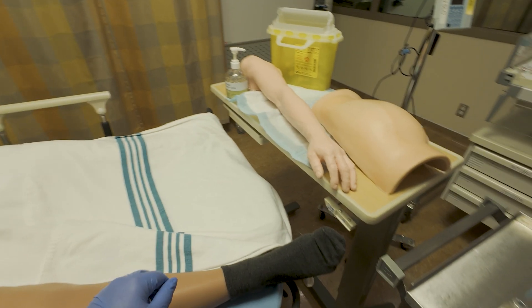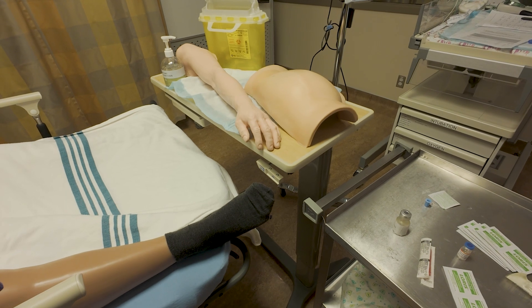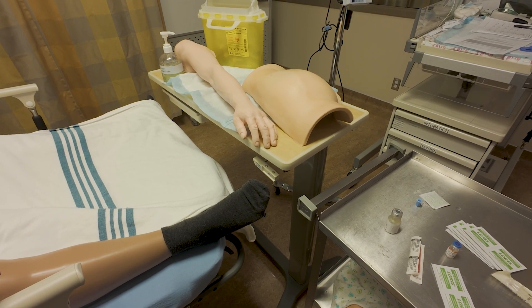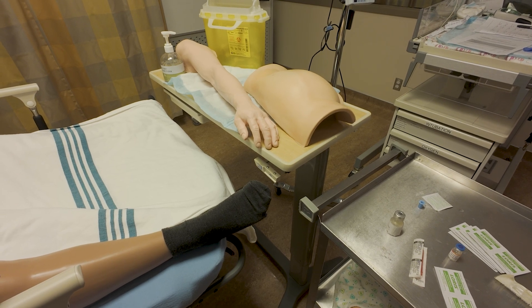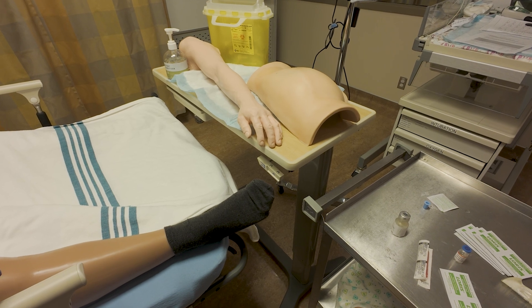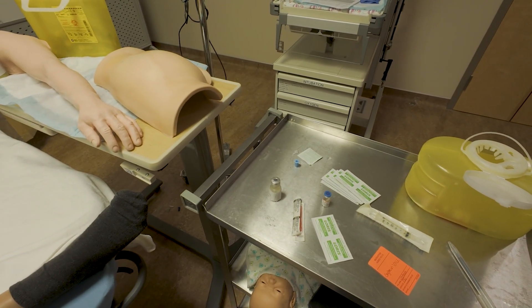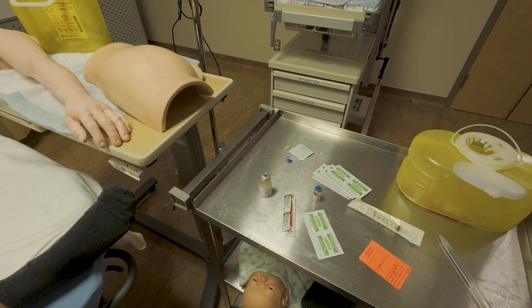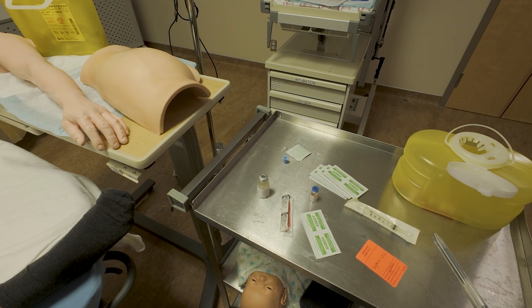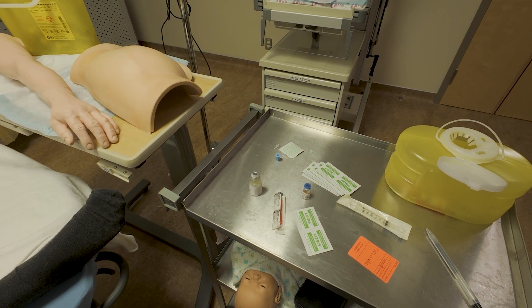We're going to start the intramuscular injection demonstration. With intramuscular injection, we need to make sure we have the proper medication, always following our 10 rights of medication administration, ensuring that our patient doesn't have any allergies to the medication we're going to give them, and having already obtained the person's consent to administer this medication. In this case, we're going to do oxytocin administration for active management of the third stage.